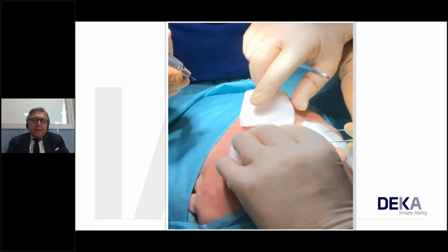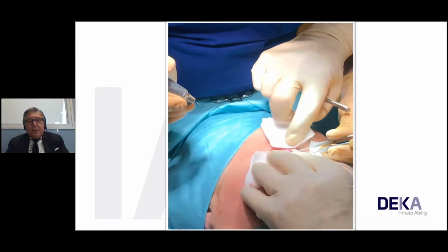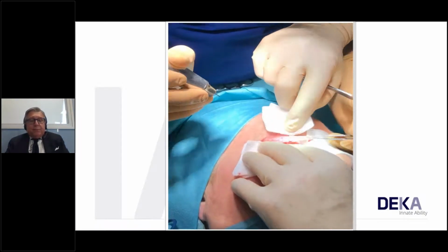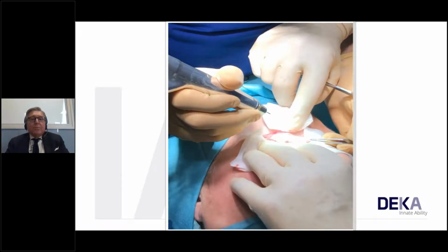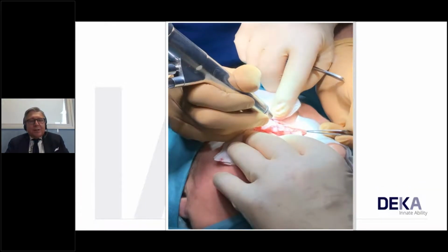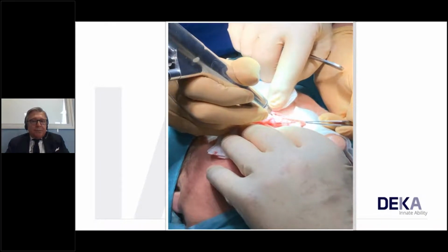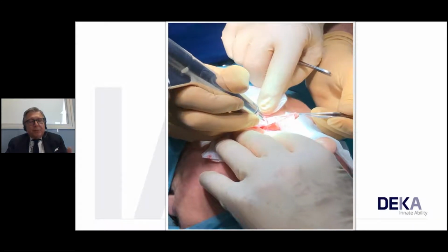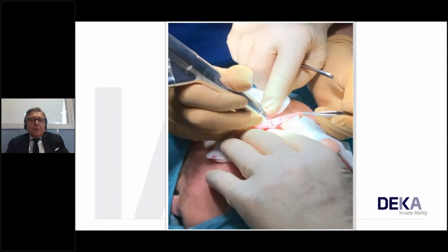This video is very significant because we can see how sometimes we need to be very precise by pinching the skin and obtain a cleavage from the orbicular muscle. Please look at how we hold the handpiece at 45-degree angle. This is very important. How we move, how we hold the handpiece. We are talking about tips and tricks. It is one of the most important tips and tricks that we can do. Please hold the handpiece in this way. On the other side, we can use the opposite angle. Exactly.